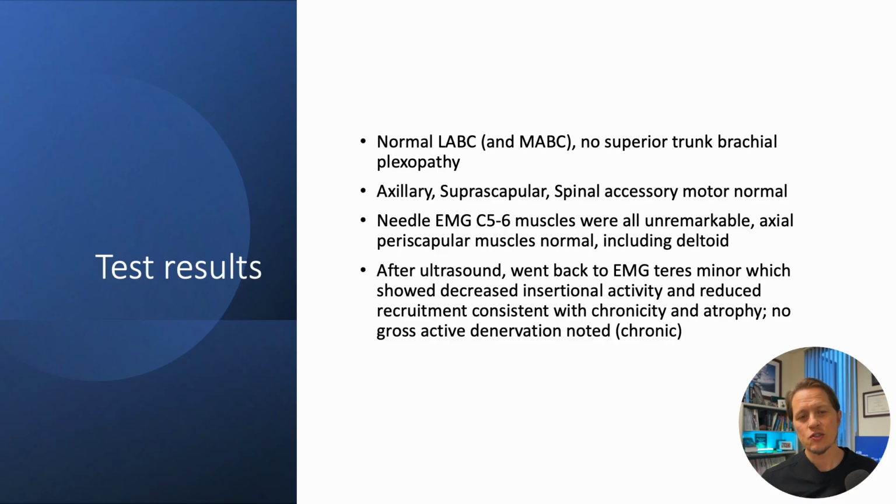So this is what actually happened in the case. I did the routine EMG, which we all do, which does not include the teres minor. Went to the ultrasound looking for more answers, saw the obvious difference in the teres minor, and then told the patient, look, can we go back and do the EMG? We need to check that teres minor. And got it, and it was so clearly positive.